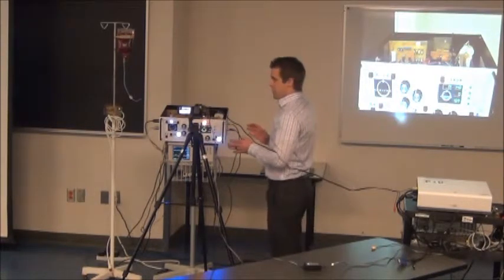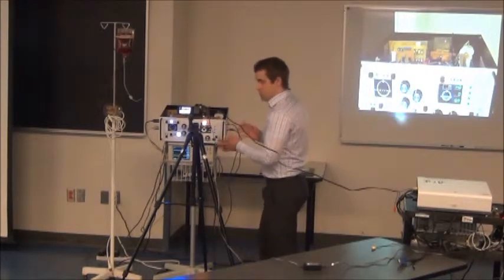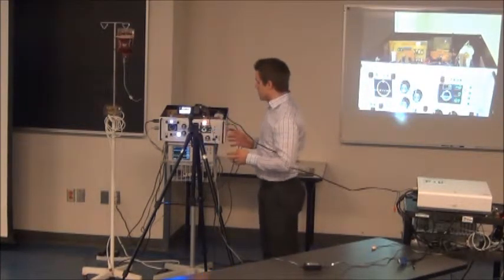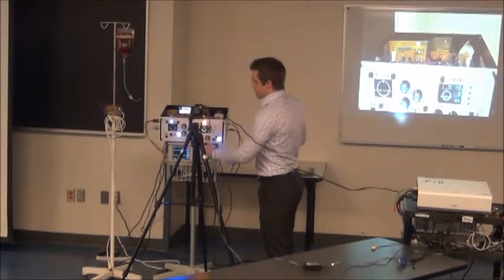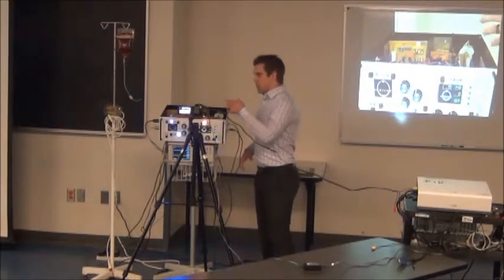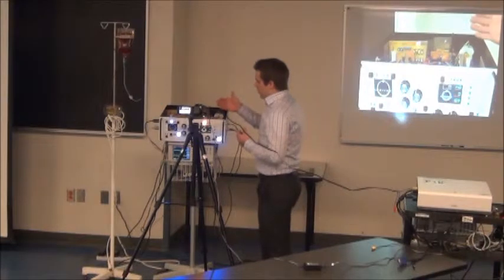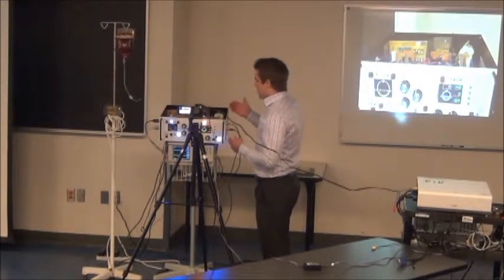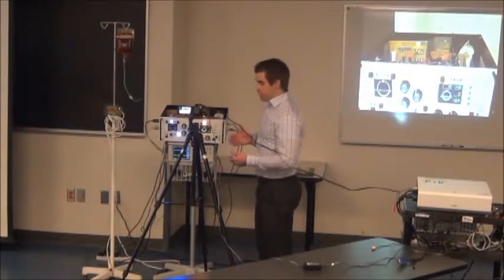We chose to do it this way because it's easier for the clinician or whoever's using the device to distinctly figure out that this is the ECG side and this is BP. And as we laid our boards out inside, we also did the same thing with our ECG on the left and BP on the right, so it was easier to go to the front panel.